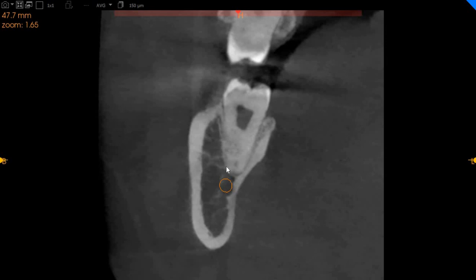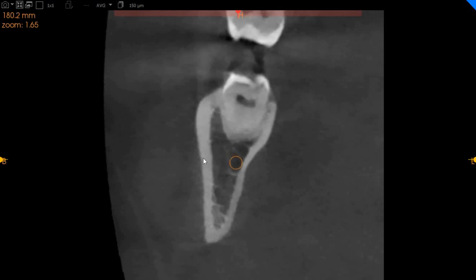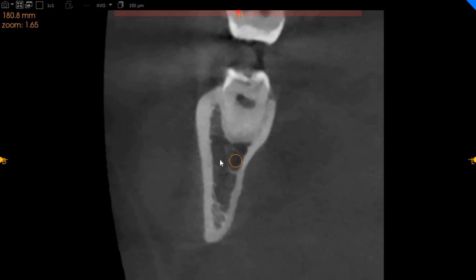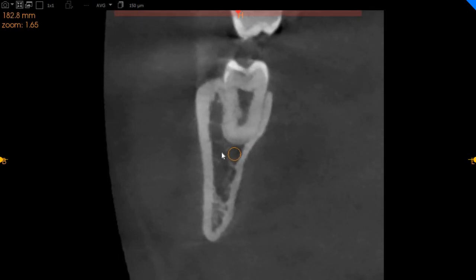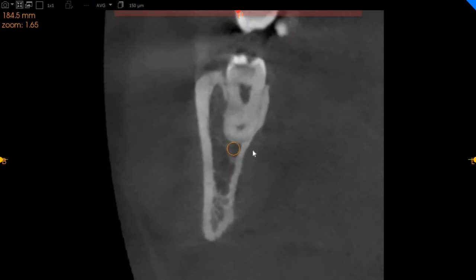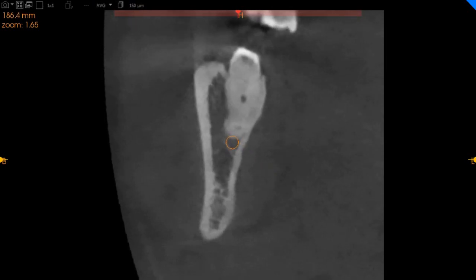Moving to the left side now, the lower left wisdom tooth is in the mesio-angular position. As you can very clearly see, the mesial and distal roots seem to be fused together, and their apex is very close to the inferior alveolar nerve.